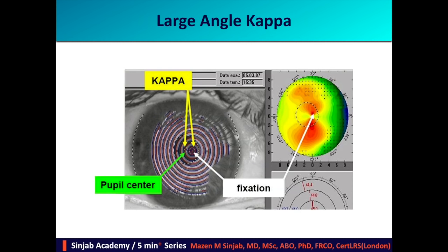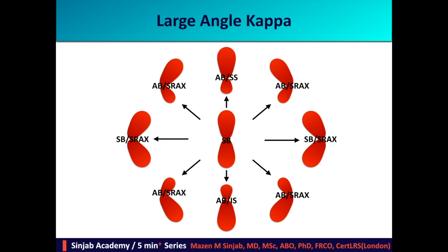Large angle kappa — this is an example of a symmetric bow tie, vertically oriented, representing with-the-rule astigmatism. If the x component of the pupil center, or angle kappa, is very large horizontally, then based on whether it is negative or positive, we will have skewed radial axis. If the y component of angle kappa is larger than normal, we will have either asymmetric bow tie superior steep or asymmetric bow tie inferior steep. If both x and y are out of the normal range, this will be complicated by skewed radial axis.